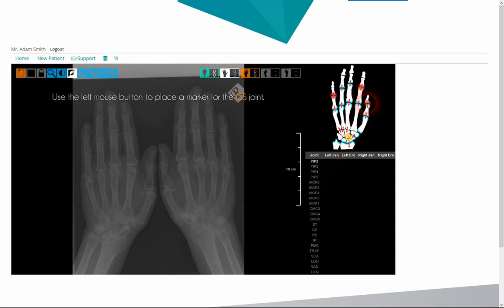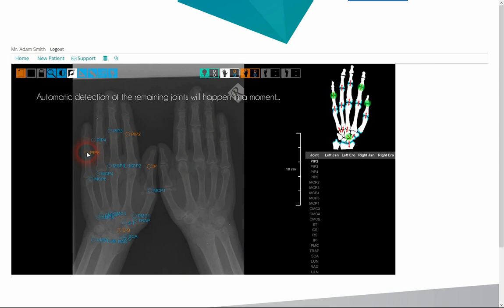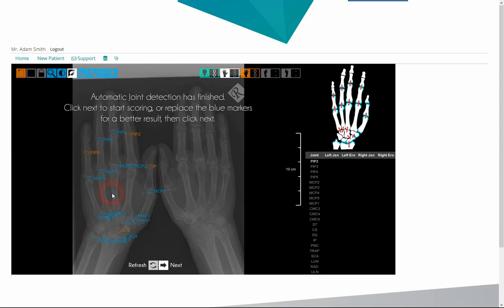We have to select four points to automatically outline the locations to be evaluated. In order, these four points are: the border of the capitate-scaphoid, the interphalangeal joint PIP2 — the second proximal interphalangeal joint — and PIP5, the fifth proximal interphalangeal joint.